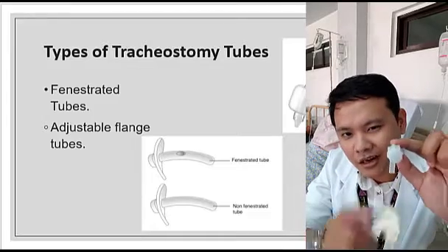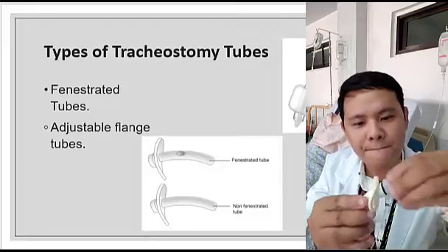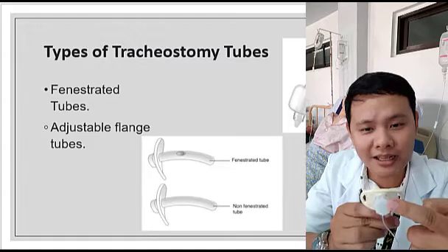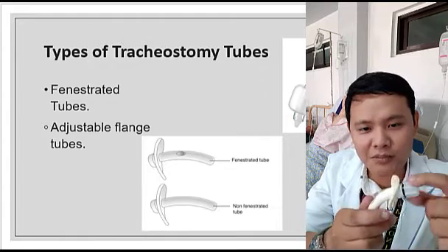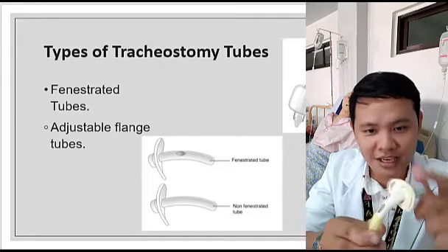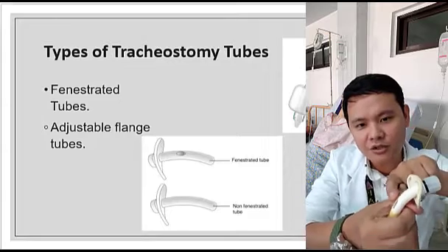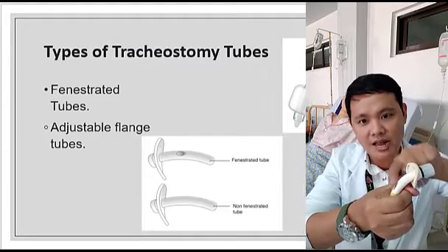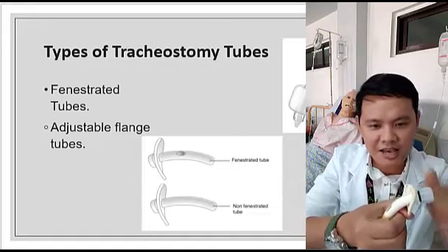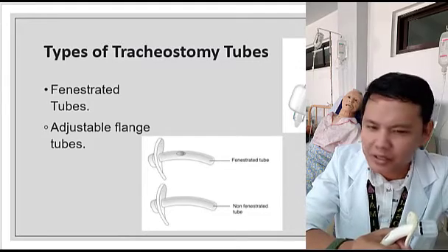And as you can see here, naka-close po siya. Okay, so pag pinasok ko po ito, lock. Pag pinasok ko to, walang hangin na papasok dito at wala ring hangin na lalabas. Rather, ang pasok at labas ng hangin ay dito po manggagaling sa may tube po na ito. Okay, so if we're going to put it in the trachea, dito na bali, in and out ng hangin. Okay, hindi na rito.